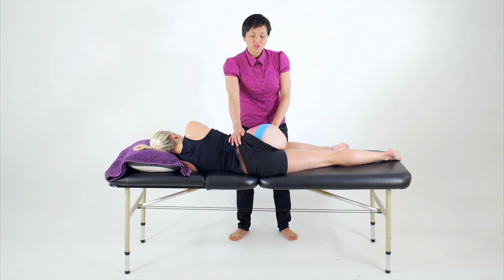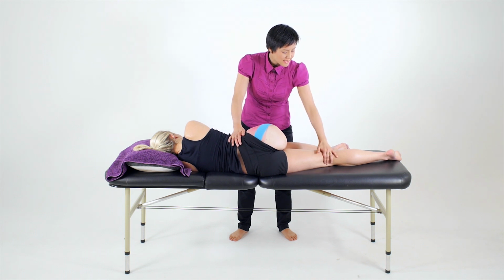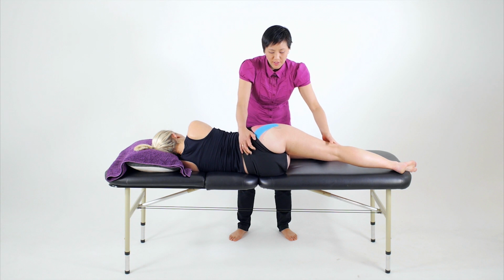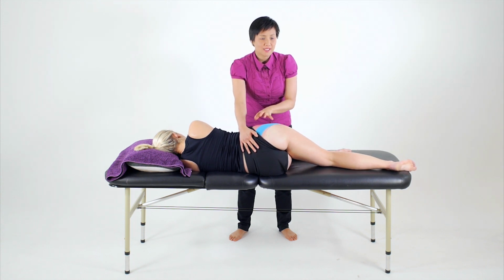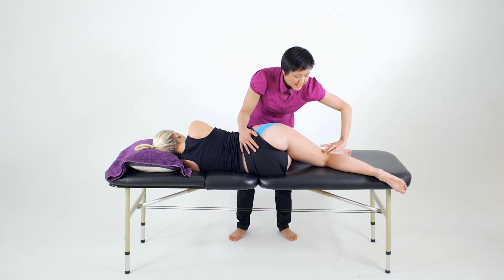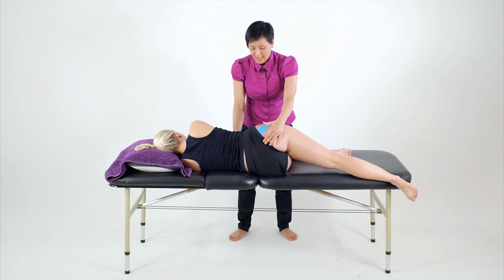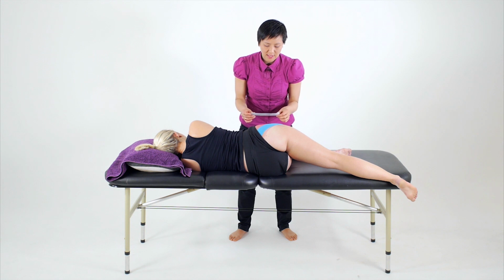Now, to move on to taping for the anterior portion of the gluteus medius as well as the gluteus minimus, we'll reposition our client, flexing the bottom leg up and extending the top leg. From here, we take the leg into adduction again, and because we're taping an internal rotator, it's okay if we drop the leg off the bed there, with the leg in extension, to get a little bit of external rotation, making sure that the pelvis is stable and holding itself forward as the hip moves into that extension.